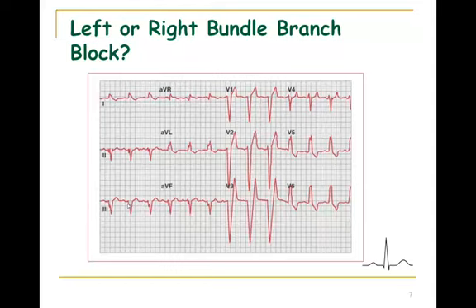You'll notice in standard limb lead 3, you see a more negative voltage, and it's kind of backed up in lead 2. So this would be suggestive of a left axis deviation, which would tend to signify a left bundle branch block. This one is not a real one, it was computer generated, but you do see the bunny ears. So I'm like, oh, it's a bundle branch block.